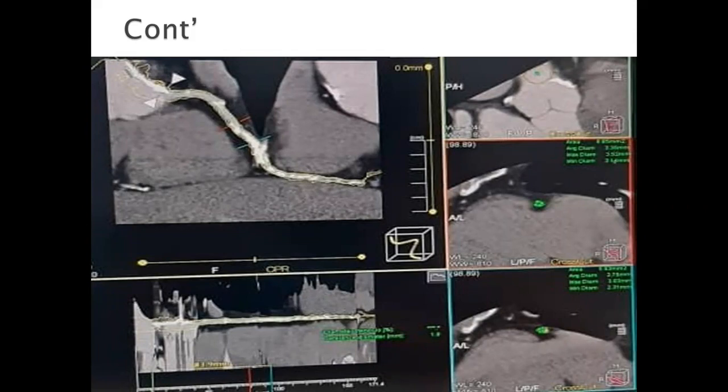And then now you start assessing the vessel from where it started. Remember, you are checking it all the way up to where it's ending. And then if you see any reduction in size, any increase in size, you document this.